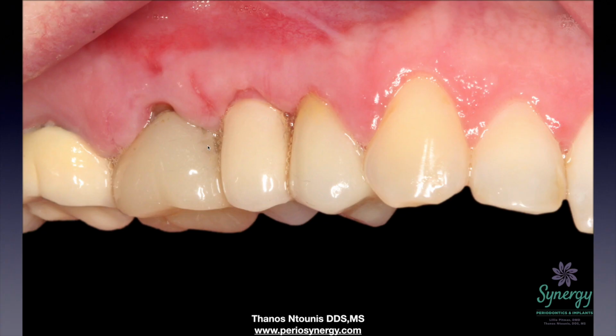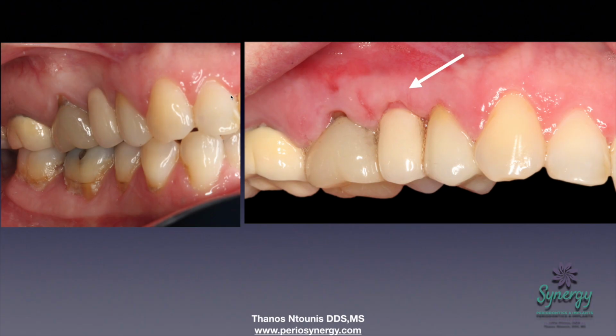And this is how the area looks 2 weeks after the procedure. It's obvious that we have gained the zone of attached peri-implant tissue. We have gained keratinized gingiva around the teeth. This is new tissue forming in this area. It's well vascularized. A better appreciation of volume. You can see here the befores and afters in that particular area.